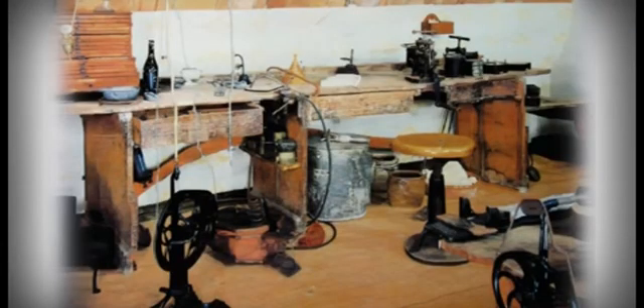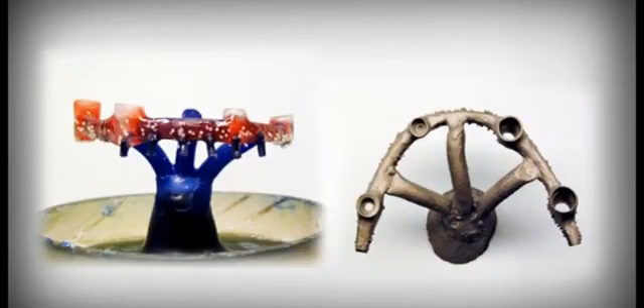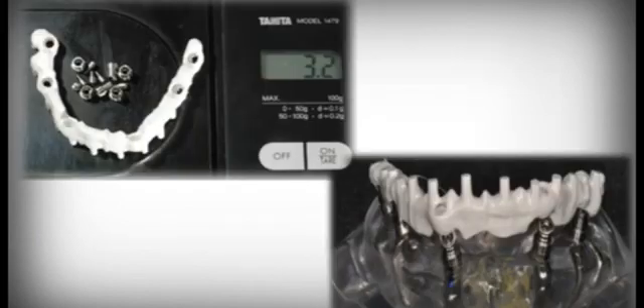The dental technician will be able to build prosthesis to perfection with normal laboratory equipment, as well as using their preferred techniques: lost wax casting, CAD-CAM milling, carbon fiber, or any other technique.